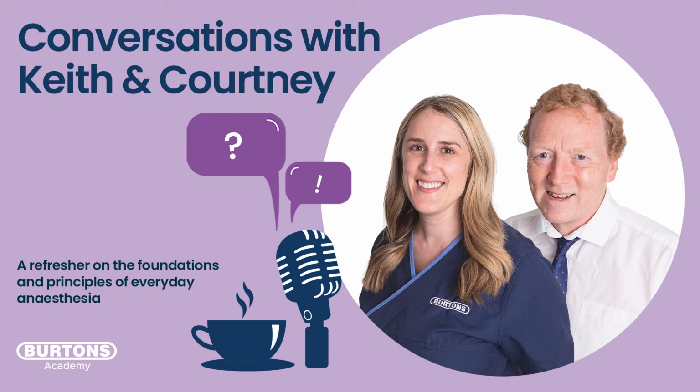The real striking change in capnography in terms of the end-tidal CO2 is when I say cardiac output, we're really talking about the delivery of blood through the lungs.